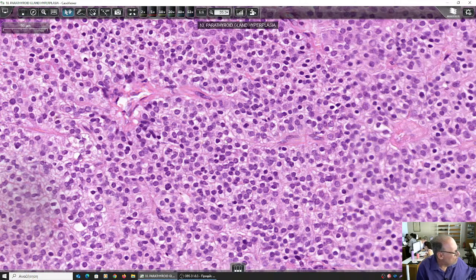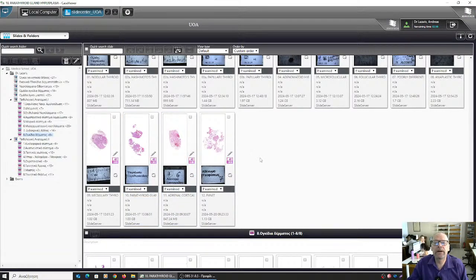paraneoplastic syndromes. That means there is some place irrelevant to the parathyroids. For the lung, there is a cancer in the lung, and it overproduces a substance that acts like parathormone and causes hypercalcemia. However, this is not an orthotopic production because it is not produced by the parathyroid cells. It's produced from malignant cells. Yes. So that is parathyroid hyperplasia, which causes hypercalcemia.